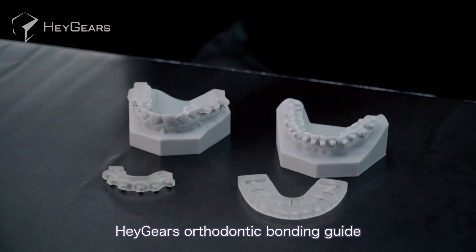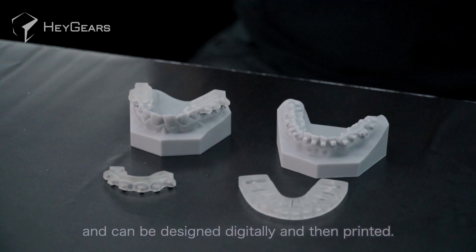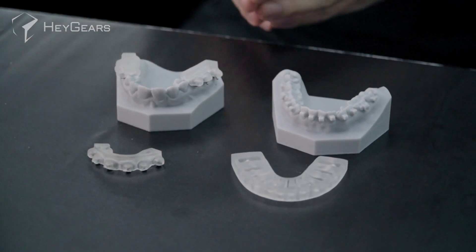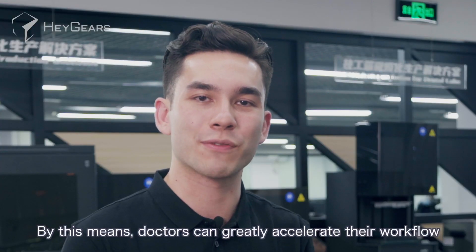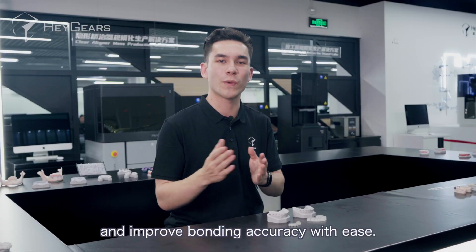HeyGears orthodontic bonding guides can be made into component sections or one piece, and can be designed digitally and then printed. By this means, doctors can greatly accelerate their workflow and improve bonding accuracy with ease.